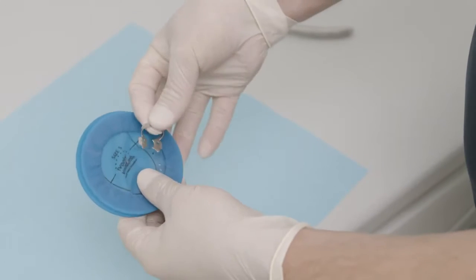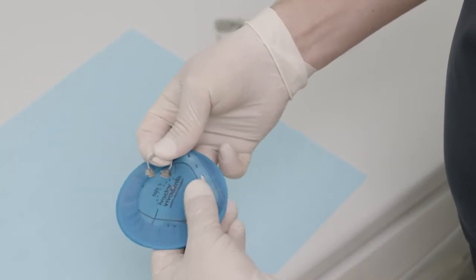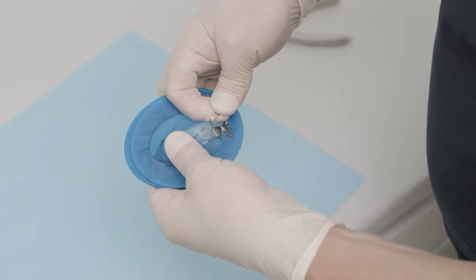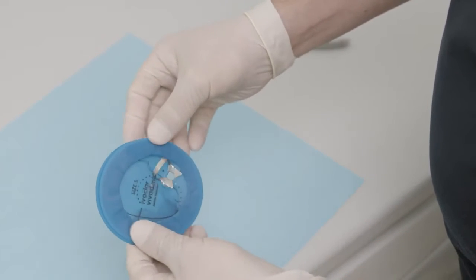An additional fixation of Optradam with clamps is recommended for the posterior region. A clamp attached to Optradam prior to insertion facilitates subsequent fixation in the mouth.